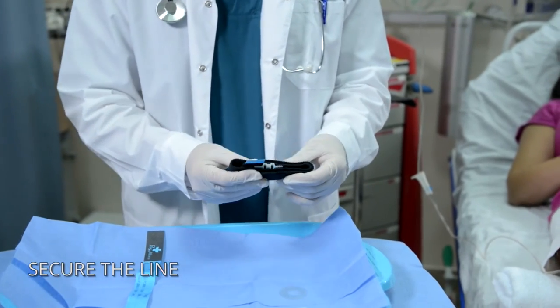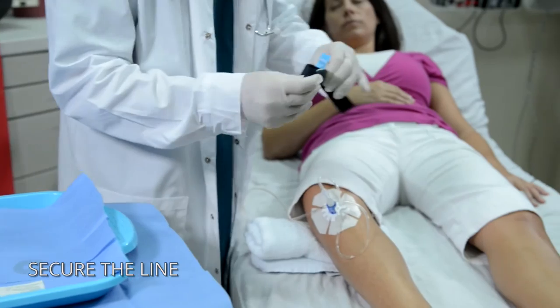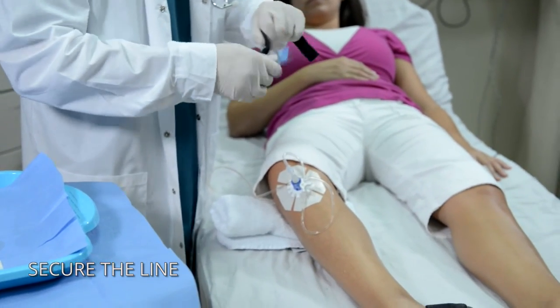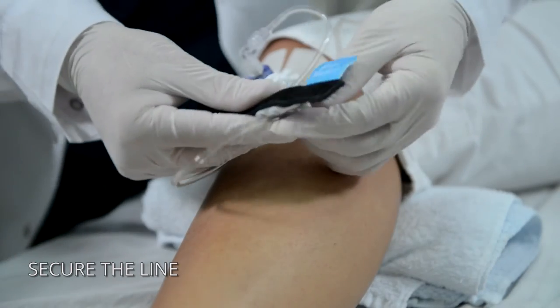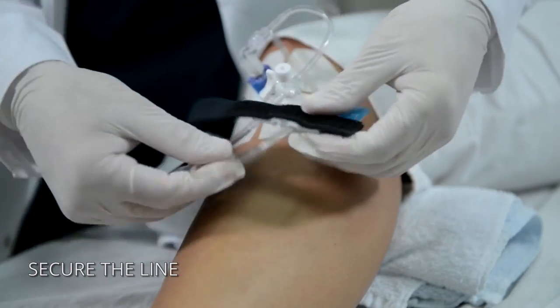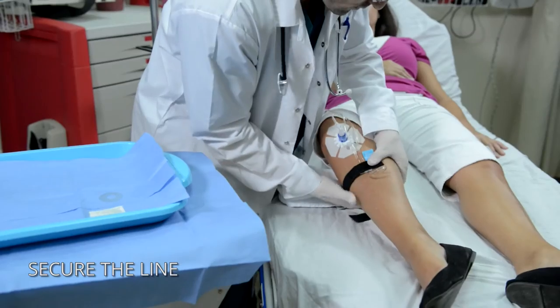Connect fluids and other items to the extension set as needed. Use the secure I.V. strap to provide protection against accidental line pulls. Snap the line into the quick-click connector channels and wrap the strap around the patient's leg near the access site.